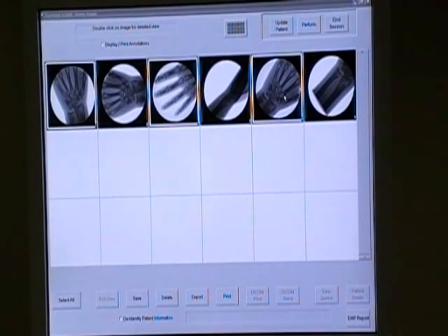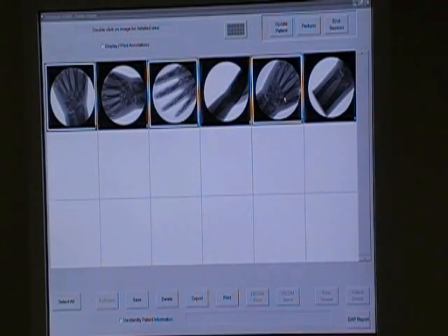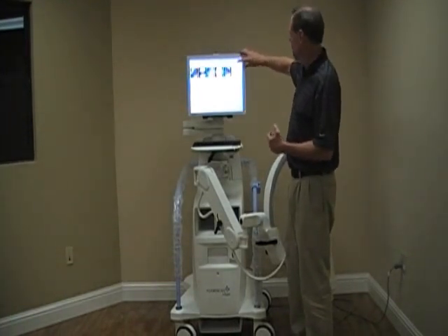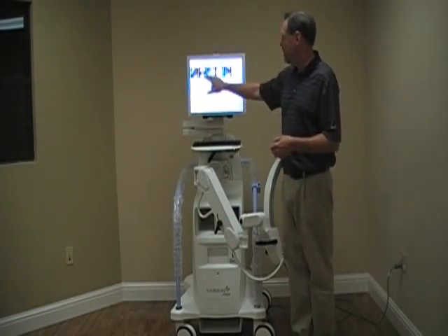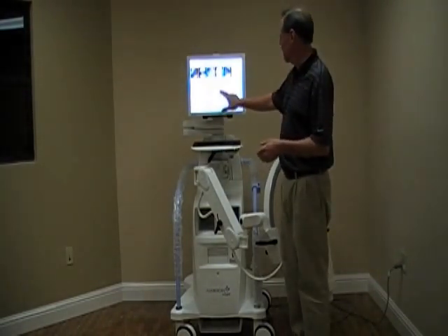If we're plugged into the hospital's PACS system, we can hit DICOM Send — that button will be highlighted and will send the images over to the PACS system. We've saved and printed the images, so we hit End Session. It asks us to review images or end session, because there are a couple images we didn't save. We don't want those images, so we go ahead and end session.